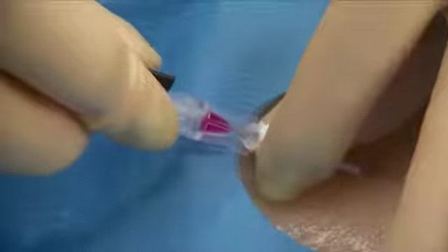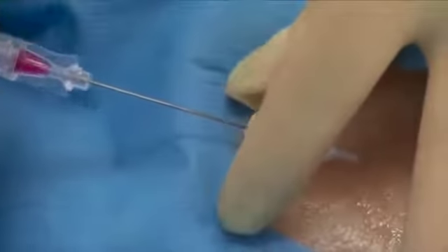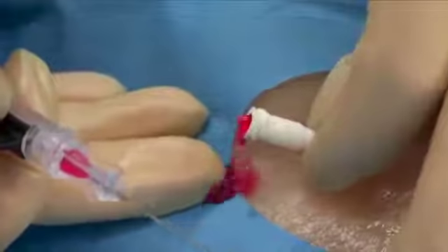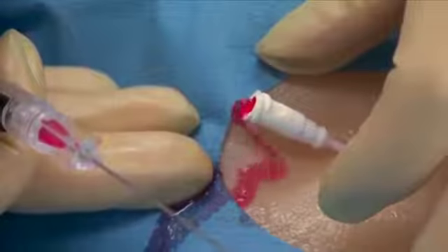Advance the catheter forward over the spring wire guide. Hold the catheter in place and remove the spring wire guide assembly. A pulsatile blood flow should be visible at the end of the catheter. This indicates a positive arterial placement.